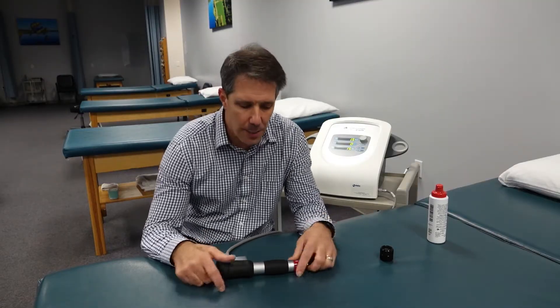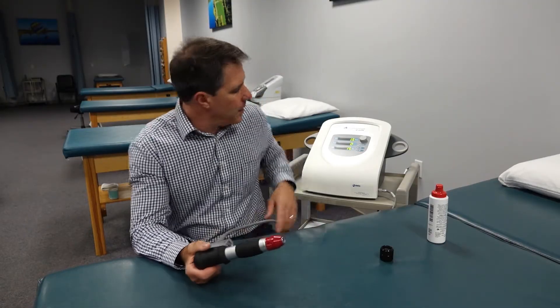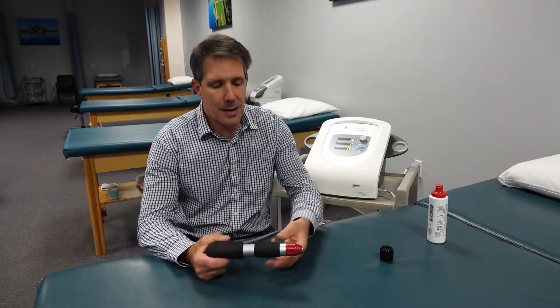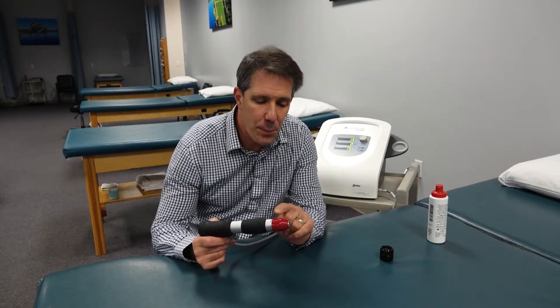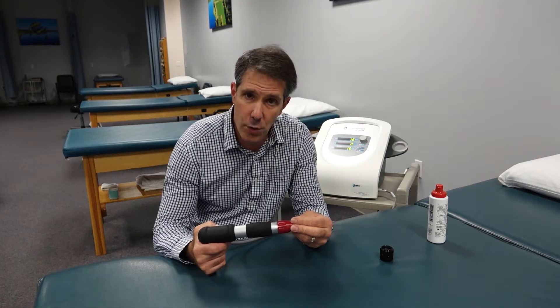So first of all, what is RPW or radial pressure wave therapy? Basically the machine is a compressor and that compressor will send some air into this head, basically pushing a little projectile back and forth producing an acoustic wave.